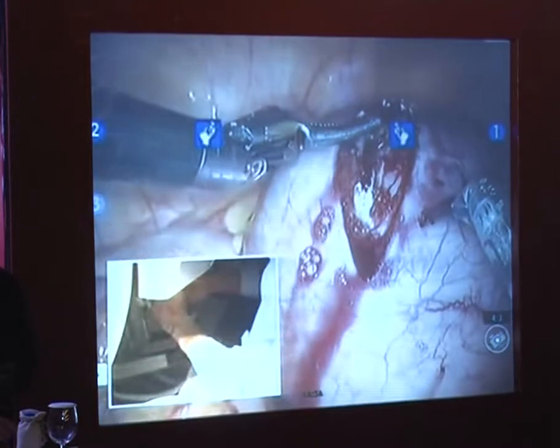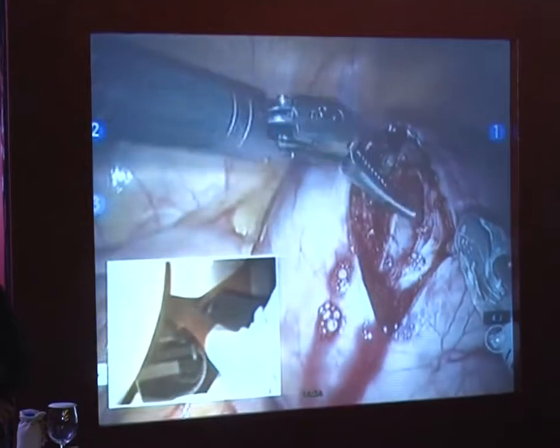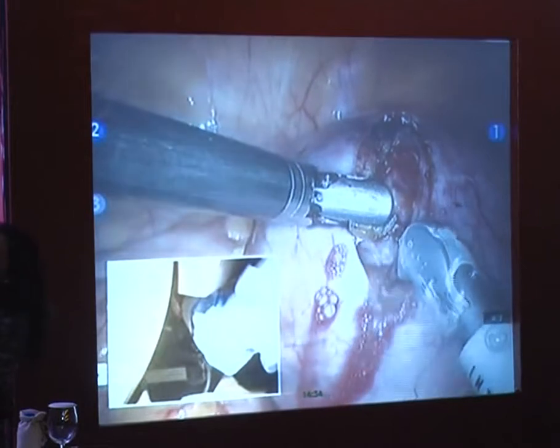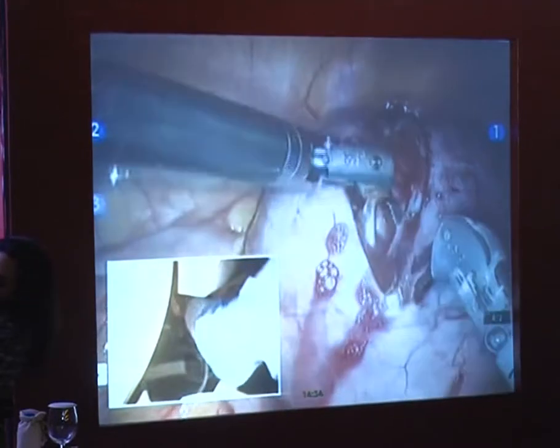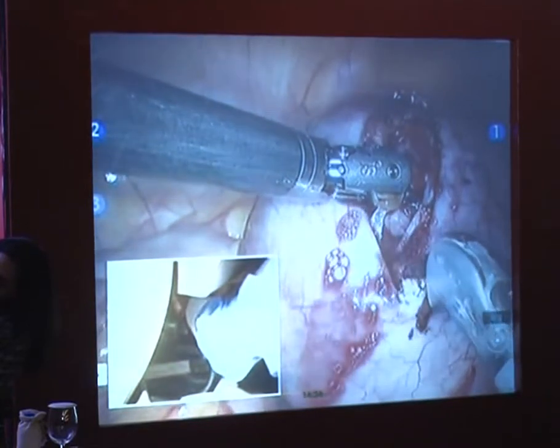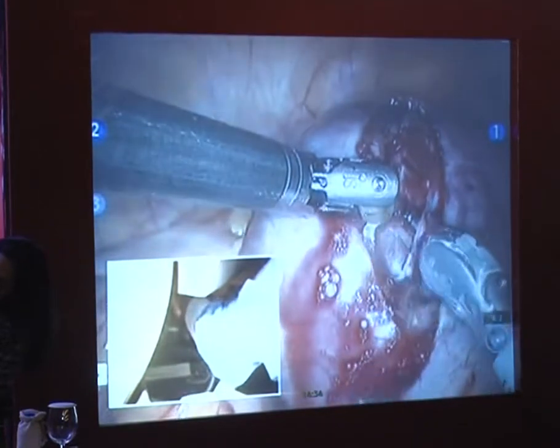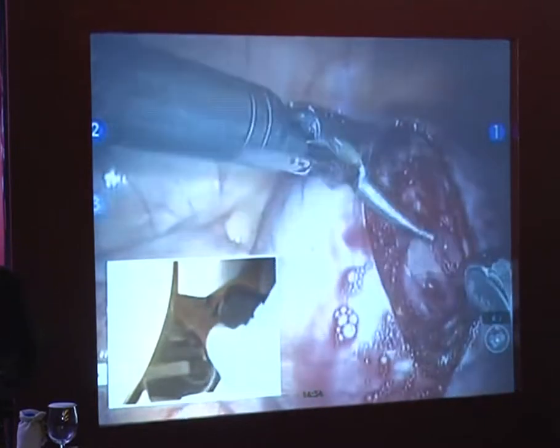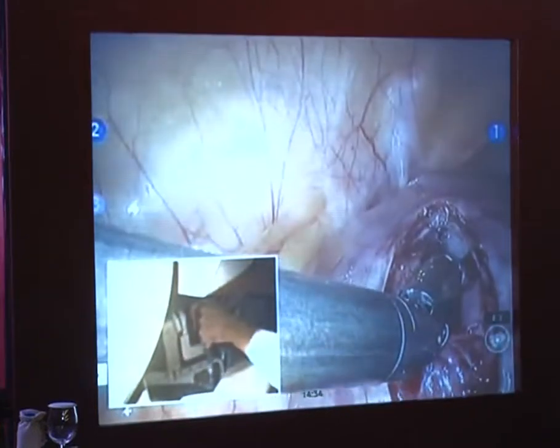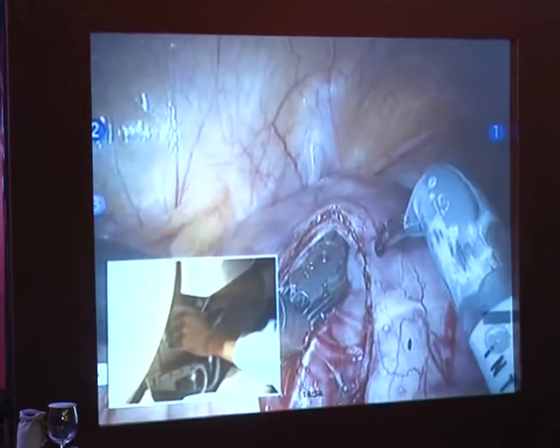But I usually run it on coag, particularly because we're using the S system. There is no cut mode on here. It's just a coag mode. So that's what I'm using right now. It's just a pure coag. But if you arc to the tissue, it really allows you to make it look like it's in a cut mode. As you can see here, I'm just delineating roughly where the dissection plane is so that I can have a good idea of it when I start to pull on this myoma, which I think I can actually start to do right now.